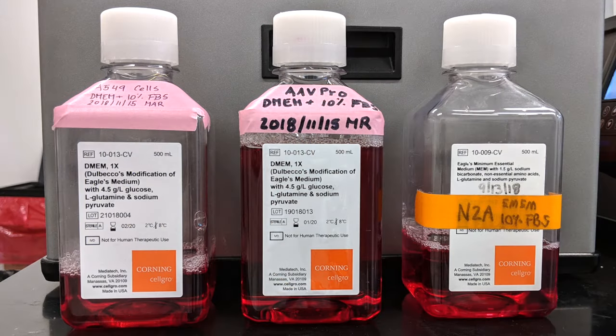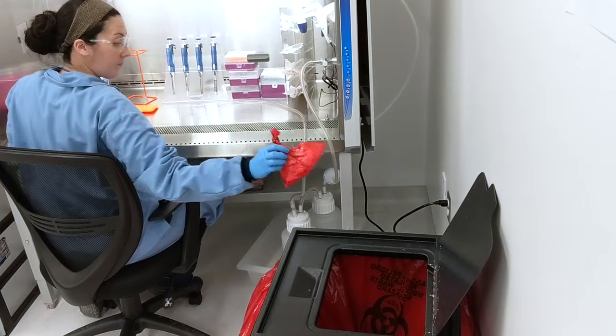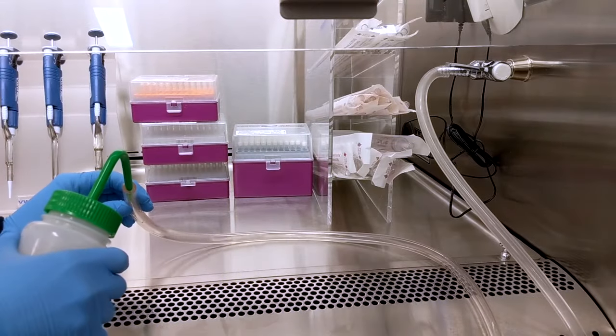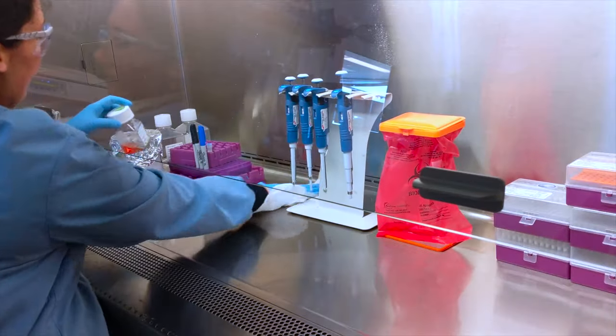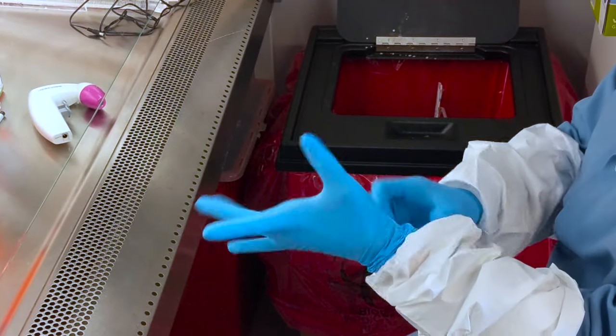We recommend using different reagent bottles for different cell lines to limit the chance of cross-contamination. When you're ready to switch to a new cell line, dispose of all trash, rinse the aspirator line with bleach, and wipe down all equipment and surfaces with alcohol. Lastly, before handling the new line, change your gloves.